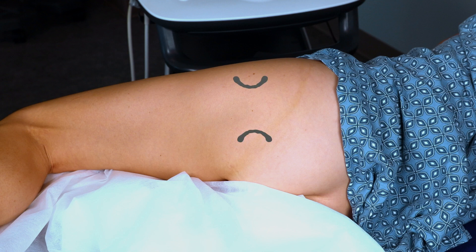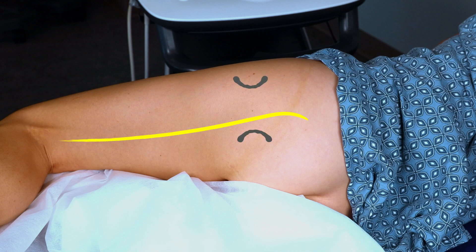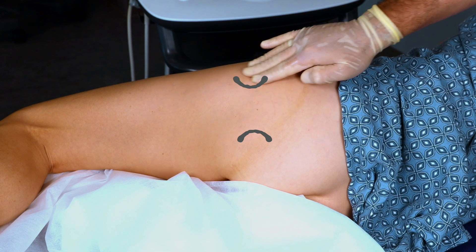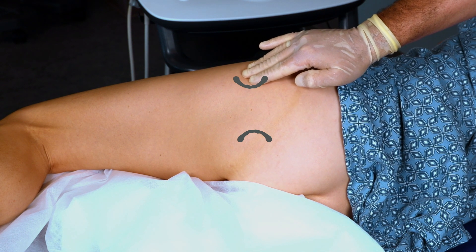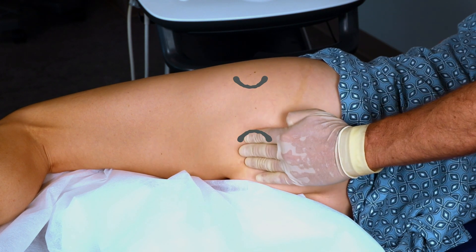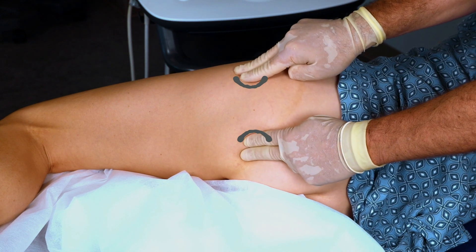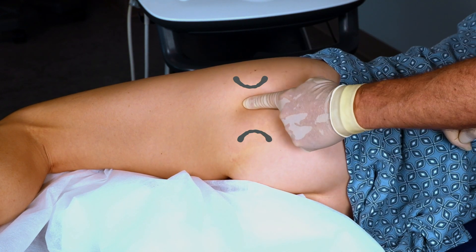The patient is positioned on their side, ideally with the hip flexed to make the bony anatomy more prominent. Our goal is to estimate where the nerve travels by palpating the surface landmarks. We feel for the greater trochanter and the ischial tuberosity. Between these two bony humps is a soft tissue trough — this is where the nerve lives and where we're going to place our ultrasound probe.